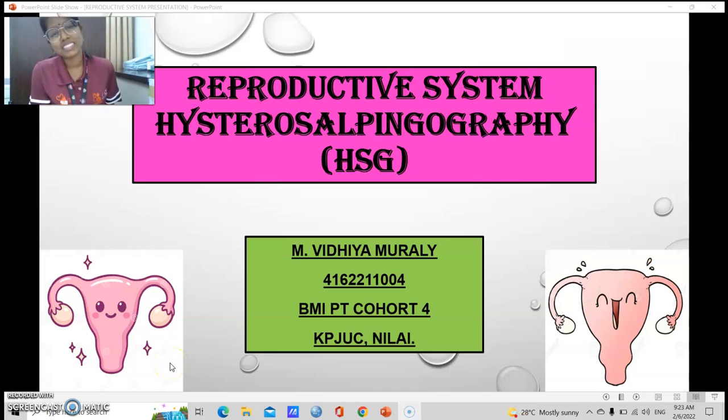Hi, I'm Vidya, studying Bachelor in Medical Imaging, cohort 4. And today I'm going to present about the reproductive system, that means HSG, which is the examination of the uterus and fallopian tube by using radiography with the injection of contrast media.